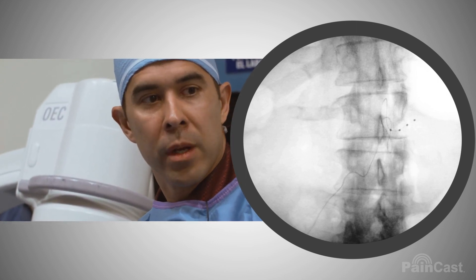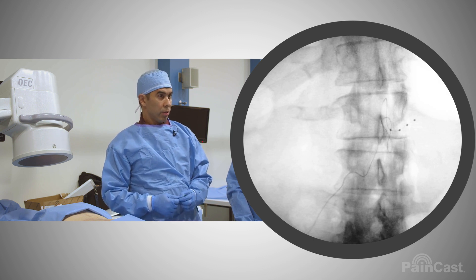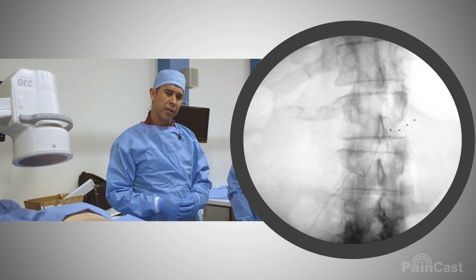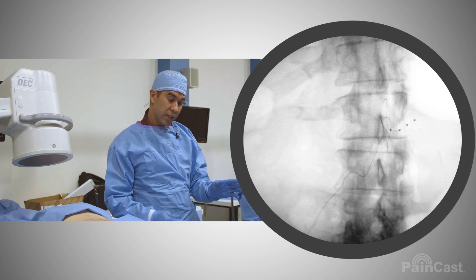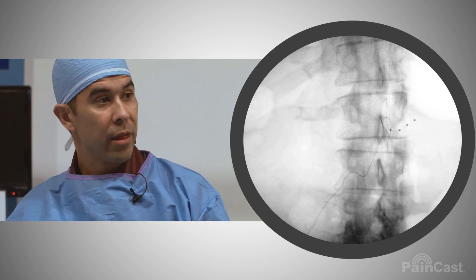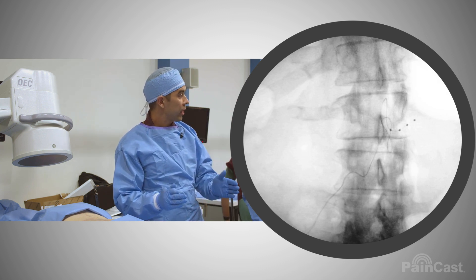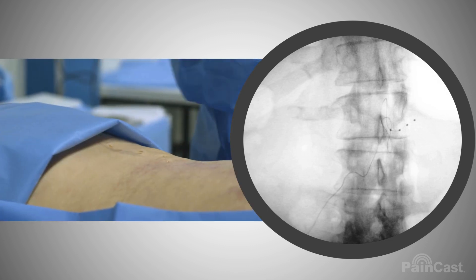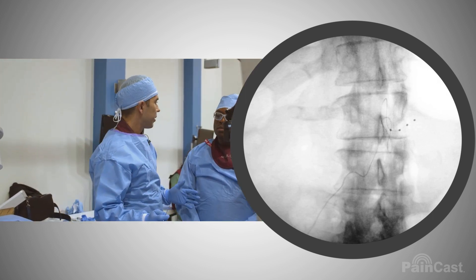So what would be the incidence of lead migration? In the lower lumbar, I don't think there's enough data. In the upper, there are two studies — Caliward and Hoyan — one had 14 patients and the other around 15, and they had four migrations each. In our case series with 17 patients and a total of 49 leads — 2.9 leads per patient — we had three migrations. So out of 17 patients, three had to go back to have the leads revised. That's around 17–25%, so you've got to anchor.